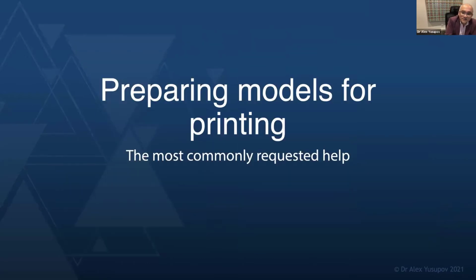So preparing models for printing is the most common phone call I get from my colleagues and my friends. They say, I just got an Asiga printer. What do I do? You know, how do I prepare it? So I'm going to take you through a process, and I'm sorry there's going to be a few videos. And this is going to be a resource, not for you guys to do it yourself, but for your staff maybe to look at how we do it and maybe attune or fine-tune their processes.